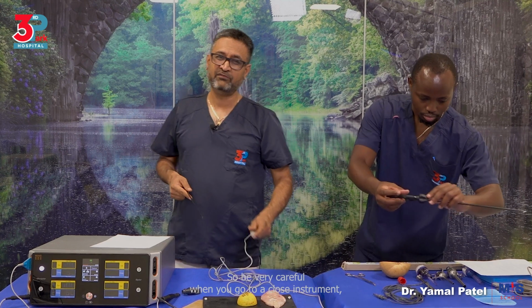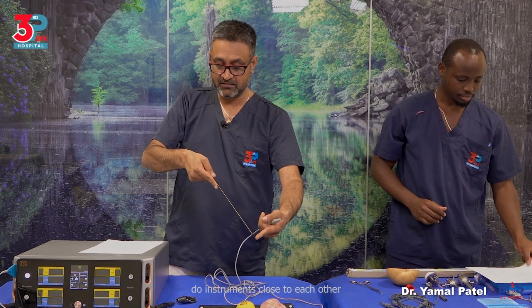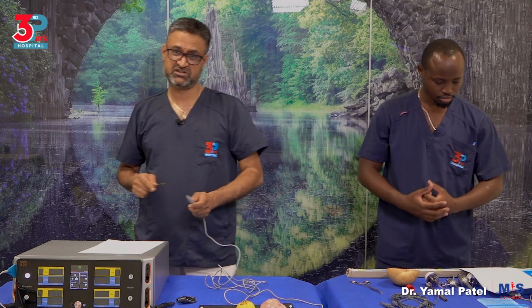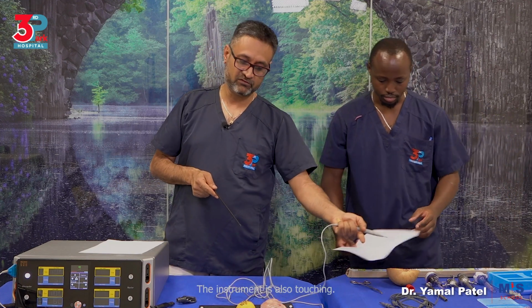So be very careful when you go to a close instrument, two instruments close to each other, and you're trying to use electricity on one. Be careful, the other one should not be touched. That will cause direct coupling and will burn whatever this other instrument is also touching.